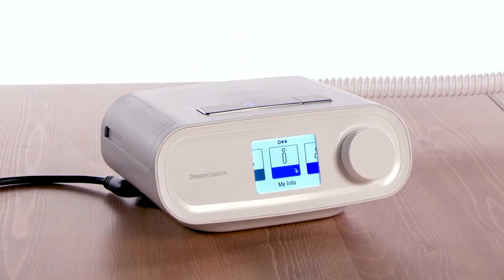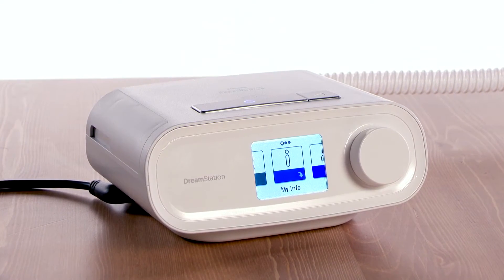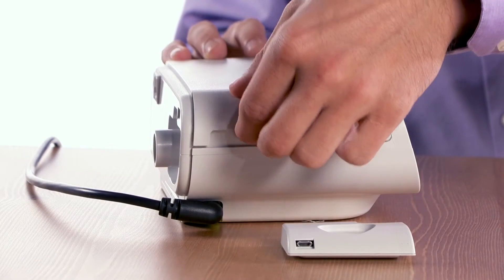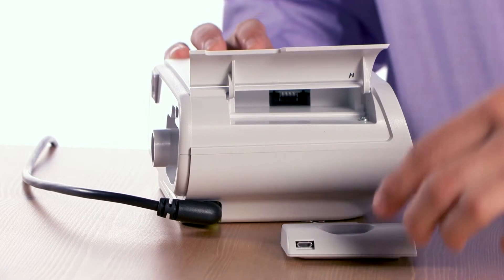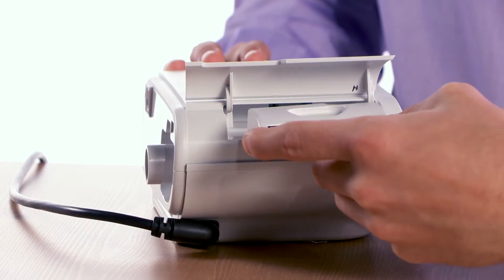Your device is capable of transmitting therapy data to your care team through a modem accessory. To install a modem, open the accessory door on the side of the device. Insert the modem module into the accessory bay, connector end first.